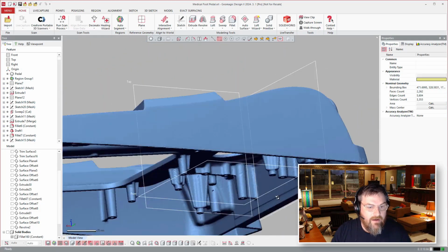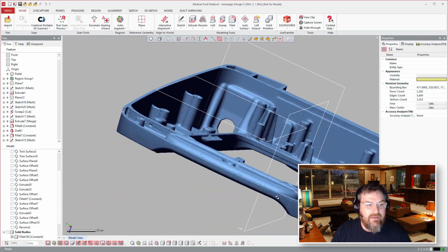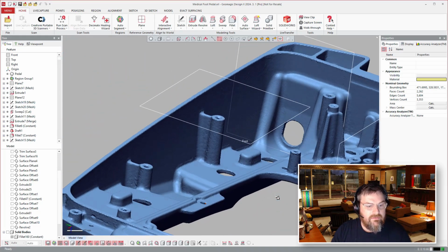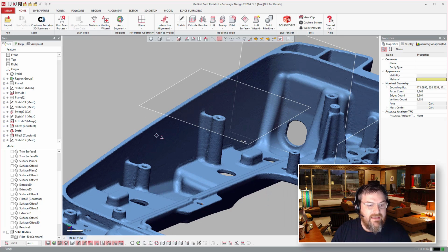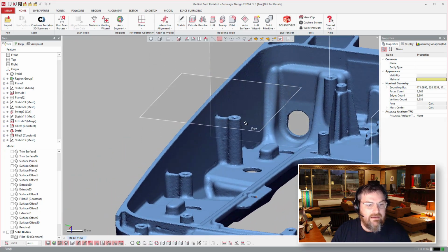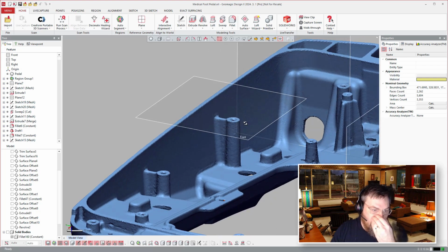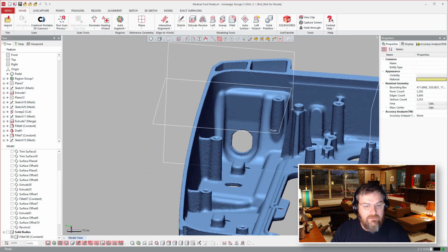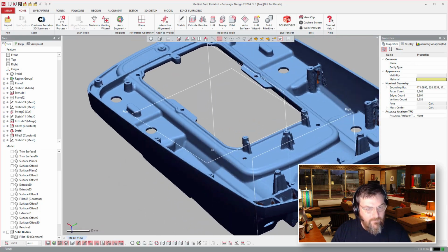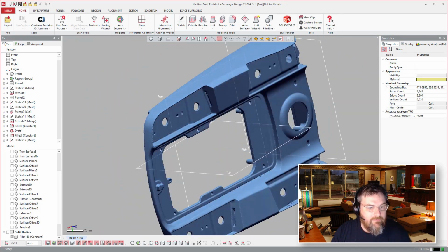It's an elaborate model. So with an accurate scanning device, one thing to pay attention to when you're looking at scanning devices is ones that can scan these thin features and maintain a good, accurate thin feature representation of the model. So as you can see, here is the model.